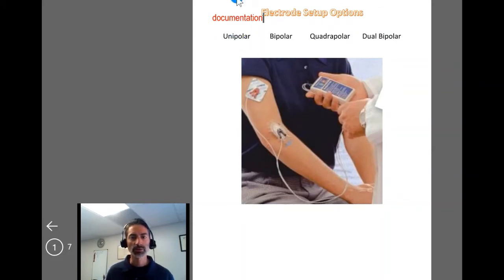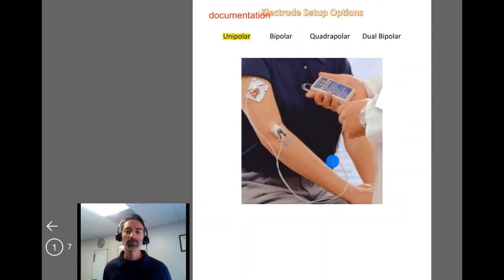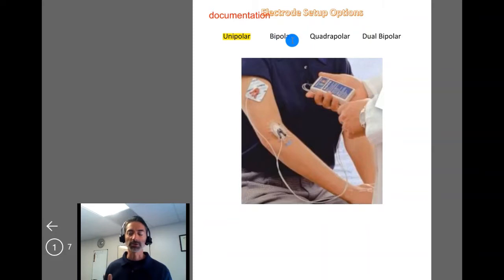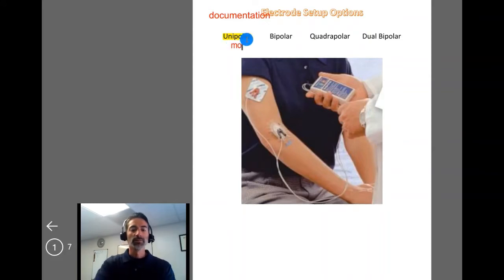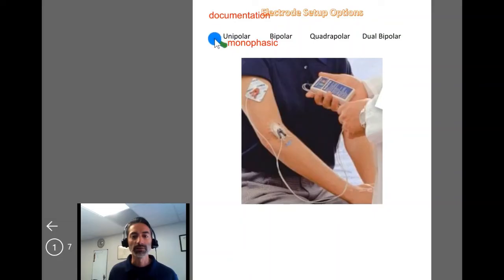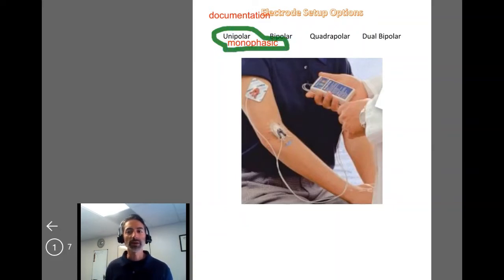The first one to go over is unipolar. A classic setup this refers to is iontophoresis. The concept of unipolar means that the current is traveling from one pole of the electrode to the other — it's unidirectional — versus bipolar, which means it's bidirectional such as with alternating current. If something is considered monophasic, it's usually associated with some type of unipolar electrode setup.